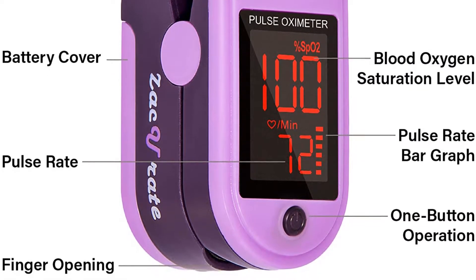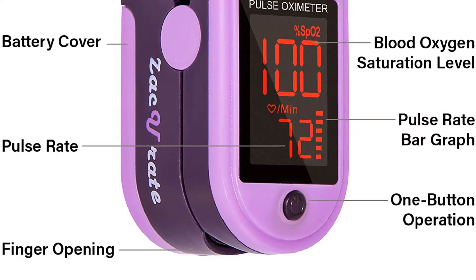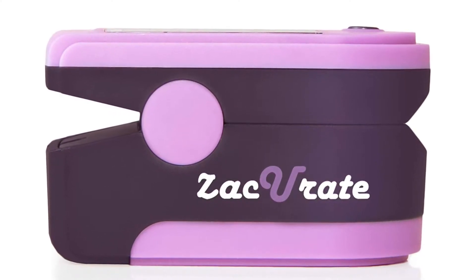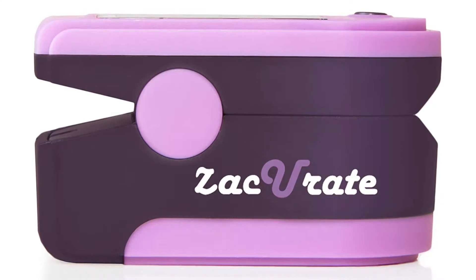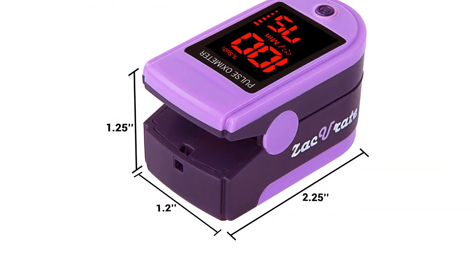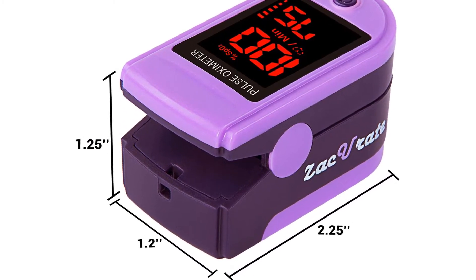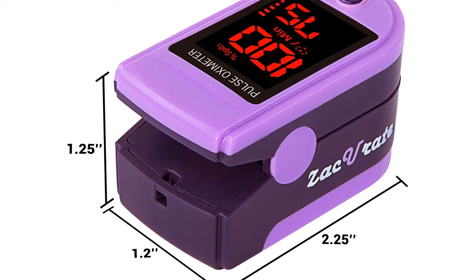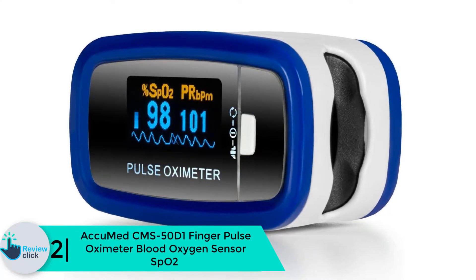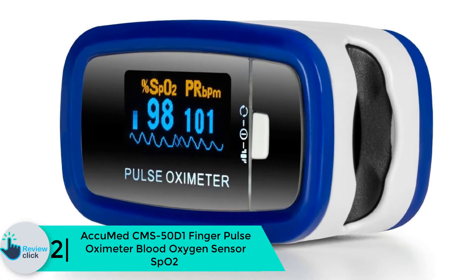The construction of this oximeter gives you peace of mind, featuring high safety design as per CE and FDA regulations and certifications. It offers 100% accuracy, with a large display and easy portability making it ideal for everyone. It utilizes two triple-A batteries, so there's no worry about batteries dying outdoors — you can easily carry extras without adding weight.